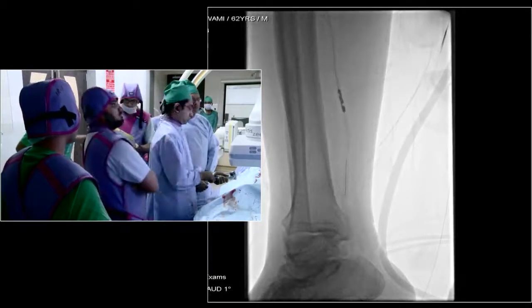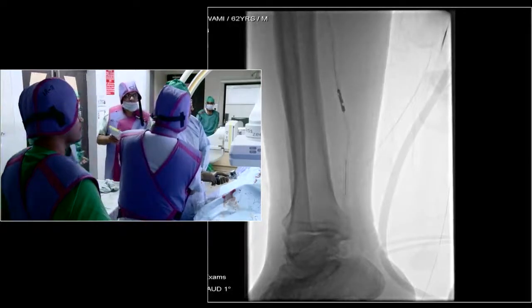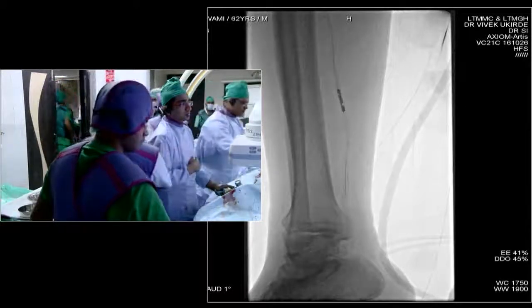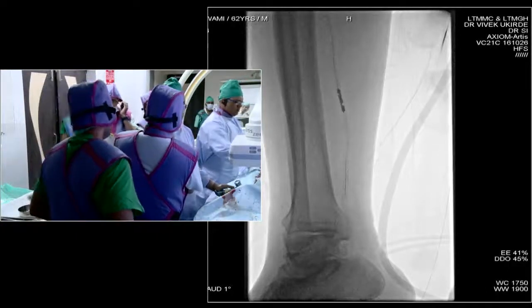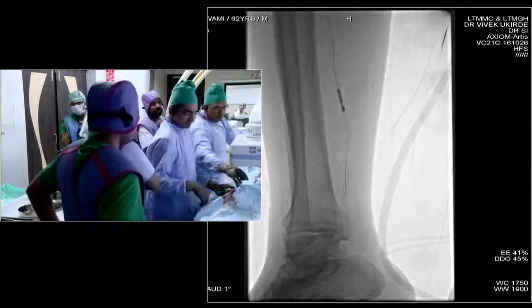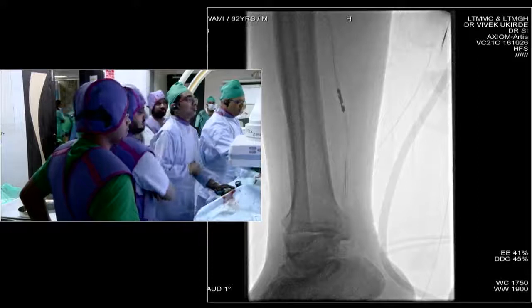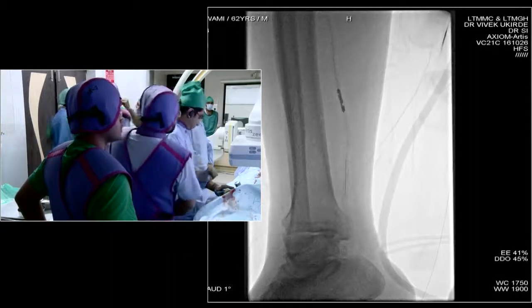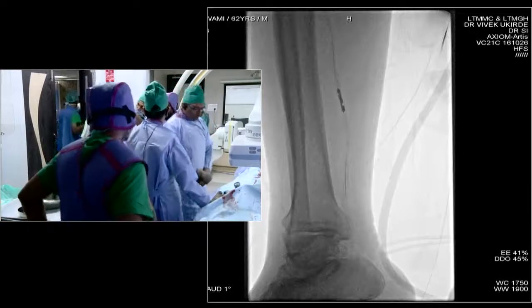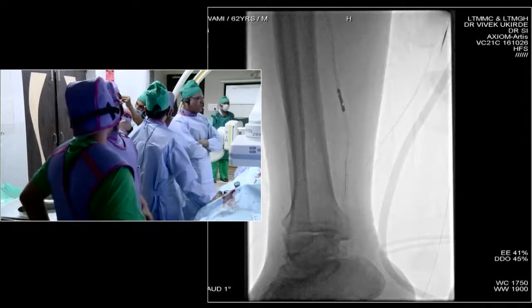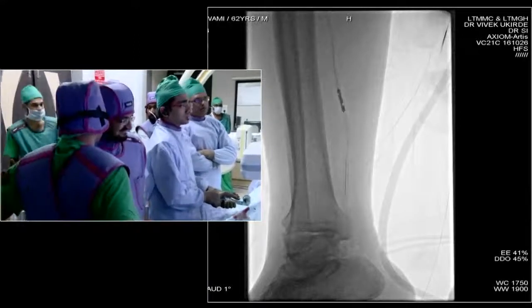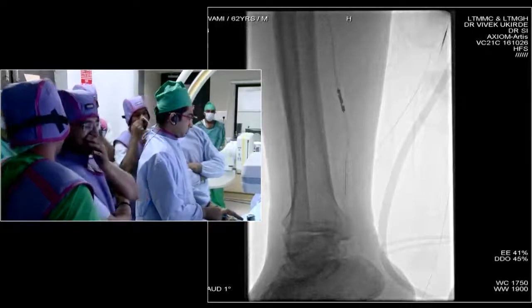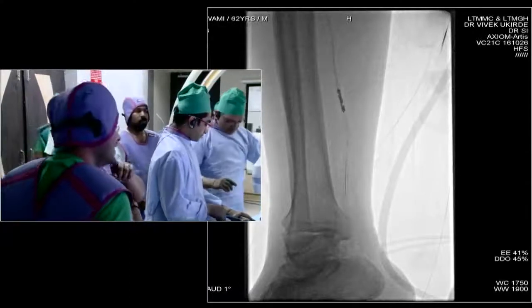For Credence BTK, the strut thickness remains 100 microns, the drug loading is 1.25 micrograms per millimeter square, the largest diameter is 4 mm, and the longest length is up to 40 mm, with starting length of 8 mm. This is more or less the same as the Embrace used for coronary. We are now at 14 atmospheres and will hold it for a while before deflating.